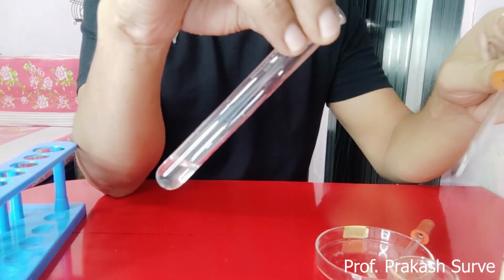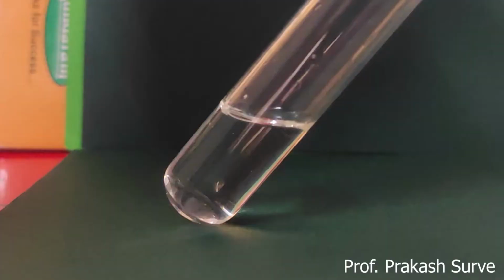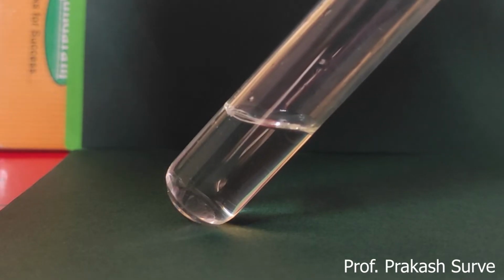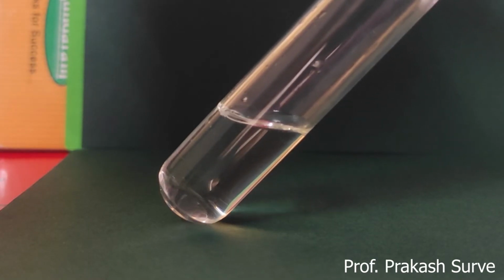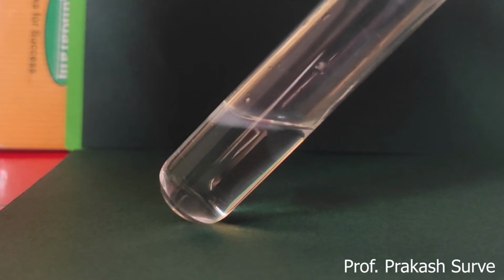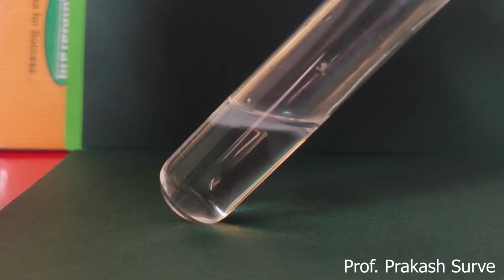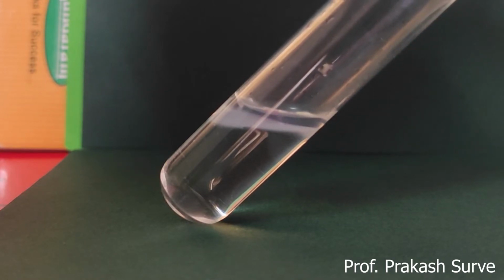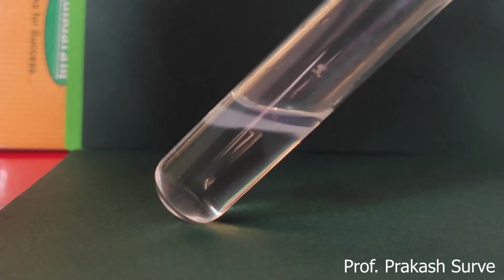We have to hold the test tube at 45 degrees, and then slowly release this urine sample, the same quantity. You have to touch the dropper to the inner side of the test tube, and slowly release this.